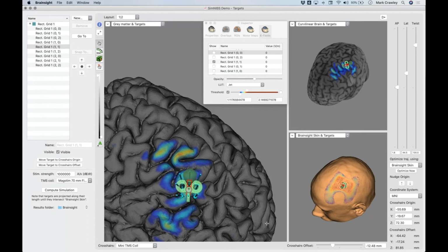For current flow modeling with TES, there's actually recommendations in a paper that I'm just broadcasting to everyone. For very accurate work, particularly for TES, it involves doing a T1 and a T2, and the T2 is included to improve the contrast between skull and skin. That's Nielsen et al., 2018 in Neuroimage. That is in the Q&A now.